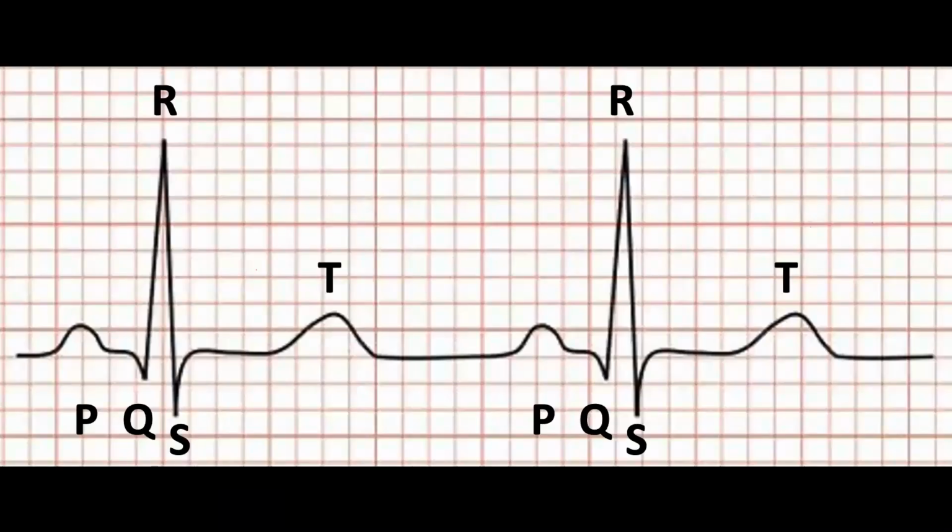So the ECG, you either love it or you hate it, probably a little bit like Marmite, and this is the normal ECG. And the ECG is a mix of a lot of letters. So you've got to love medicine. You know, you start in medical school learning about A, B, C, D, E, and then for good measure, we chuck in a bit of PQRST. And so this is the normal ECG.